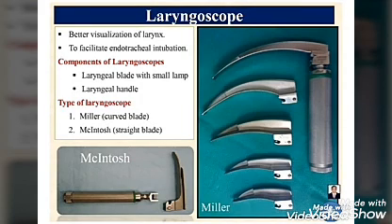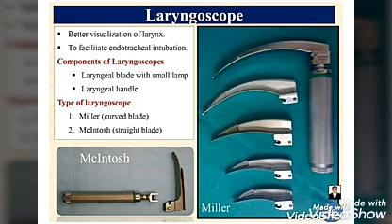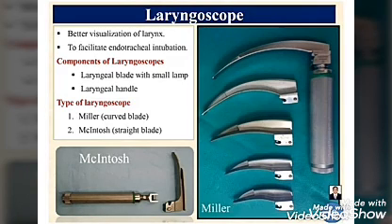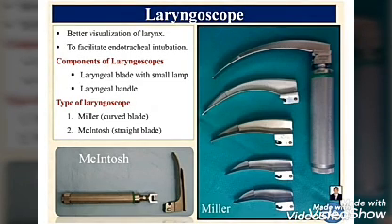It is easily available in the human pharmaceutical market. This instrument is very useful for facilitating the introduction, meaning intubation, of endotracheal tubes, and different types of blades and lamps are available with the handles. If you don't have this instrument in your clinic, don't worry about it. A torch pen light is also useful for the administration of the endotracheal tubes.